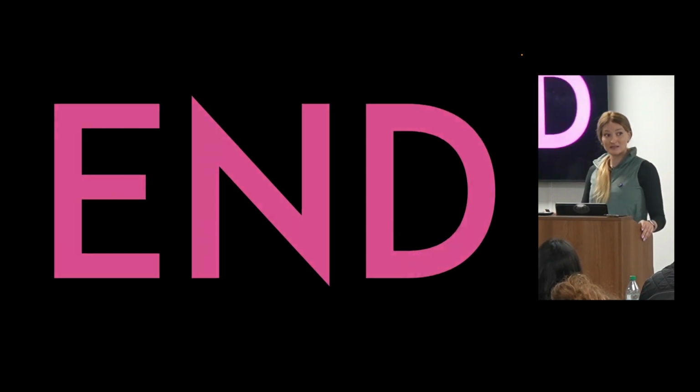All right. That is the end of part 1. Remember, based solely on the traditional things that we have at the bedside, like our physical examination and x-ray, we might actually miss significant thoracic aortic pathology, but when you have the ultrasound at your fingertips, it really lowers that threshold for that diagnosis so you can catch these life-threatening pathologies before they become deadly.